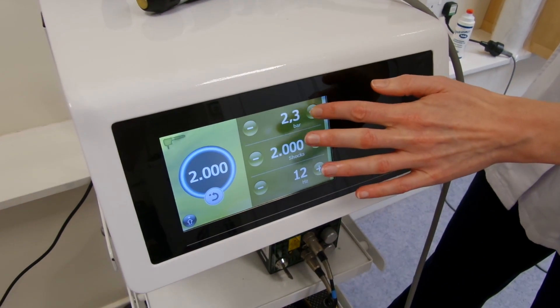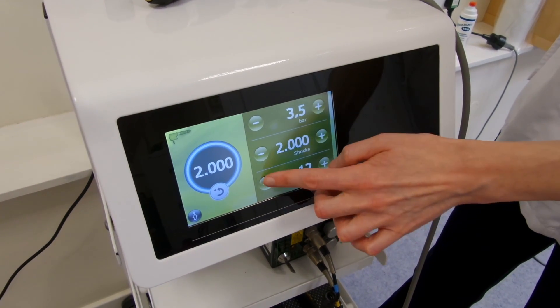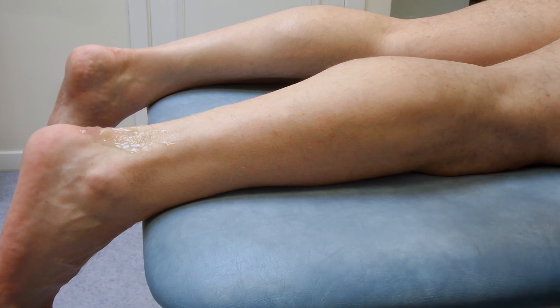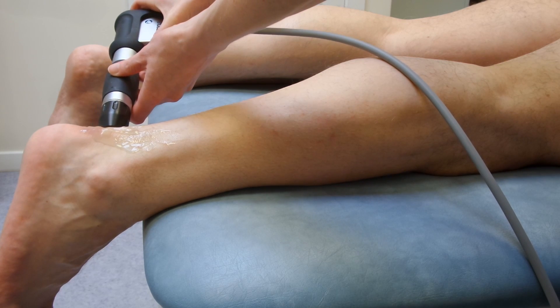We usually use more pressure for bony heel spurs, so we're going to go up to 3.5 bar. We're going to go to 2,000 shocks at 10 hertz. We've applied some gel to the leg and we're going to start by doing spots of 200 shocks.